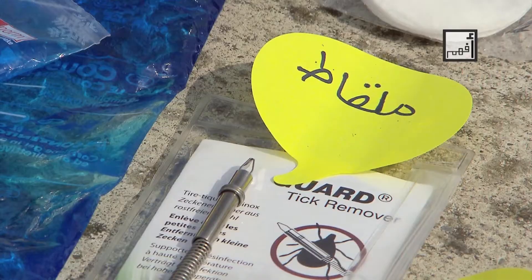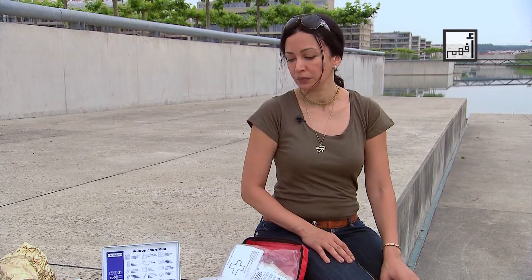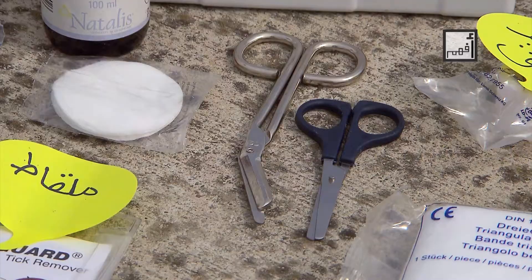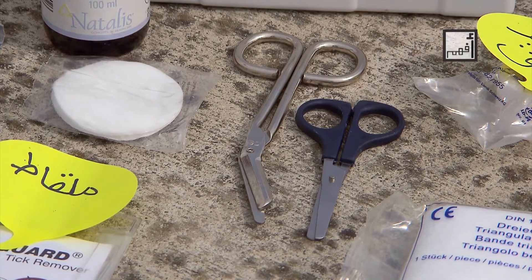The adhesive band is used to keep the elastic bandage or gauze secured in place. Sometimes we may need forceps, especially if living in countries known to have ticks. Forceps can also be used to remove thorns or glass embedded in the skin. Medical scissors are characterized by having a certain angle or having rounded ends.